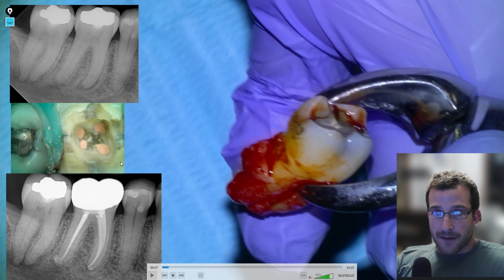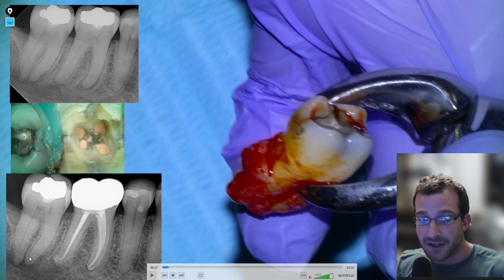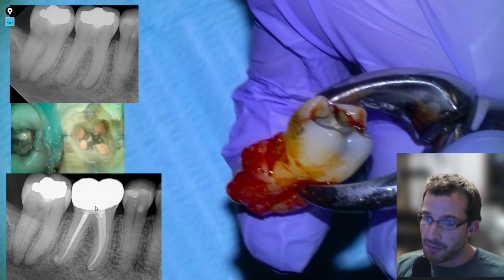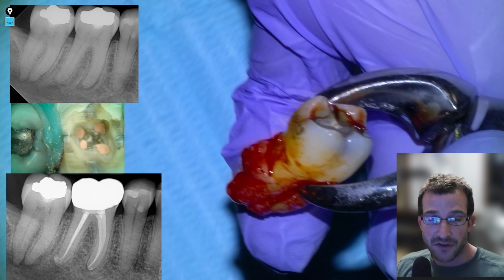It turns out that the 4-7 had the exact same affliction, maybe a little bit more subtle on the initial investigation, but here we can see more clearly that there is a lesion on the 4-7. It turned out to have the exact same presentation, with a crack line down the middle of the tooth, deep amalgam, negative pulp test, positive percussion. Basically we can do the exact same thing as we did for the 4-6, endo and crown. We had a good outcome there, so we'd likely have the same type of outcome on this tooth.